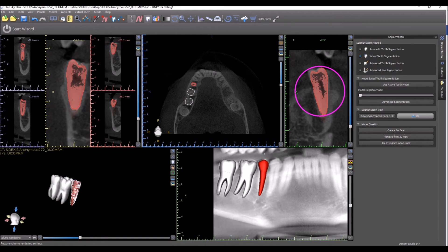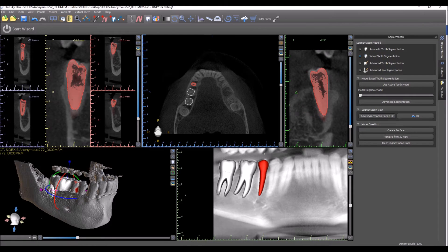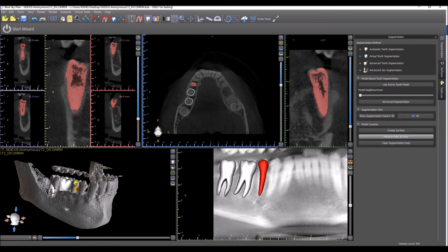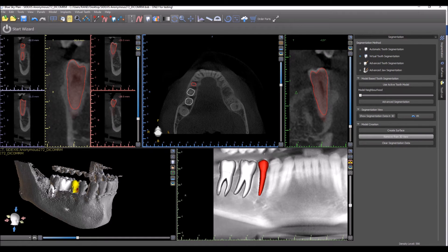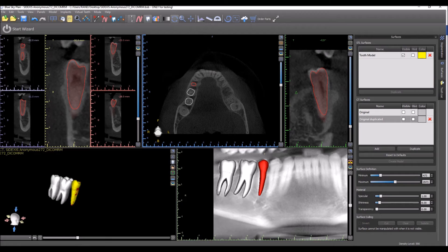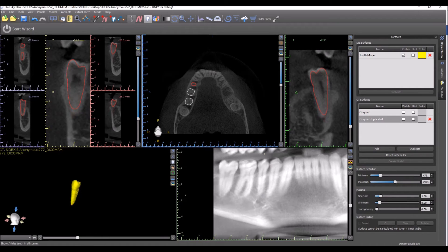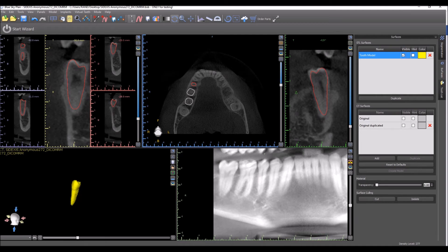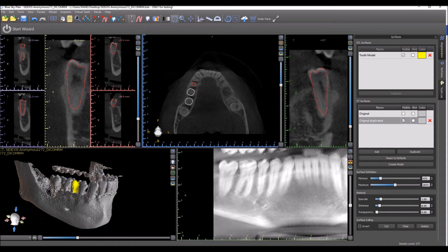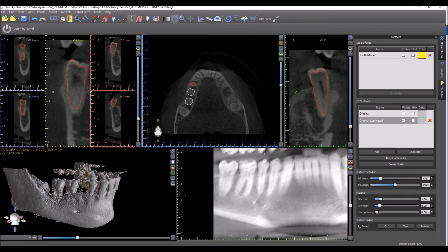Let's turn back on the virtual teeth and go back to our full CT scan. Now we're actually going to press 'Create Surface,' and this is going to create our extracted tooth as its own surface, and we're going to remove it from the 3D view. If we go ahead and switch to our surfaces panel, we could see that the tooth now exists as its own surface. Let's hide the virtual teeth temporarily — there's our tooth surface, and if we turn on the CT, we could see the tooth is now missing.